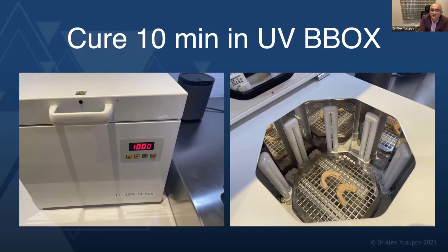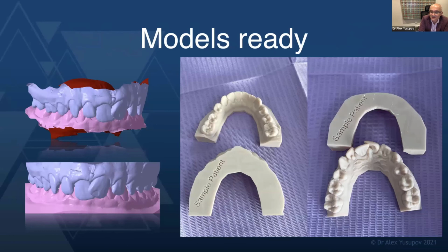So the models are now ready. They've been labeled, they've been printed. The print quality and the resolution is just superb. They are so crisp. I just love these models.